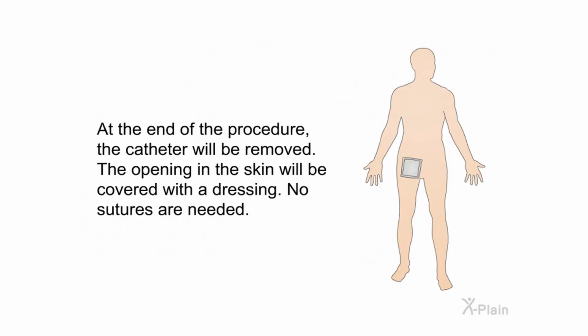At the end of the procedure, the catheter will be removed. The opening in the skin will be covered with a dressing. No sutures are needed.